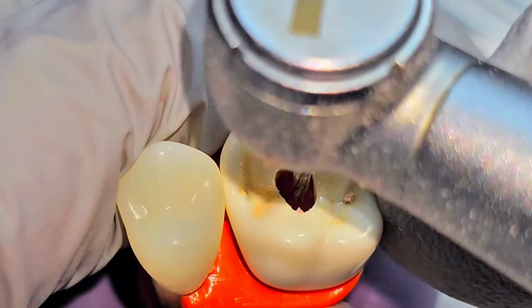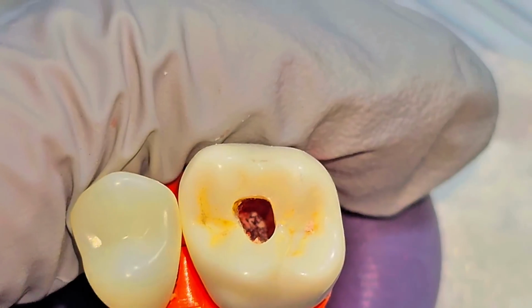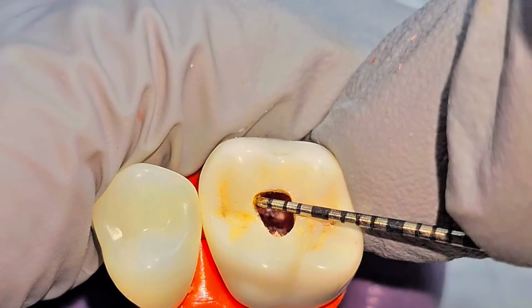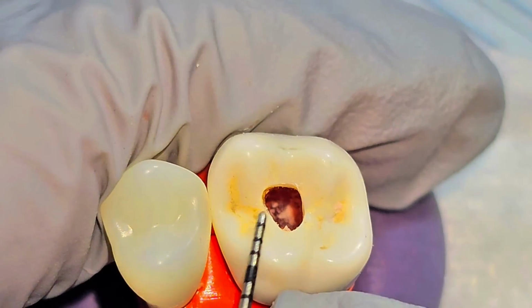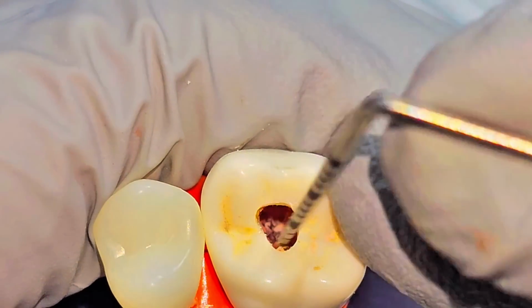And I'm gonna just do a slight more touch, because let's see, it is more than 2, so the widest is 2 millimeter. Let's make it a little bit bigger. Since it is following this groove, let's make this area a little bit wider. And buccolingually we have 3 millimeters, we have enough.